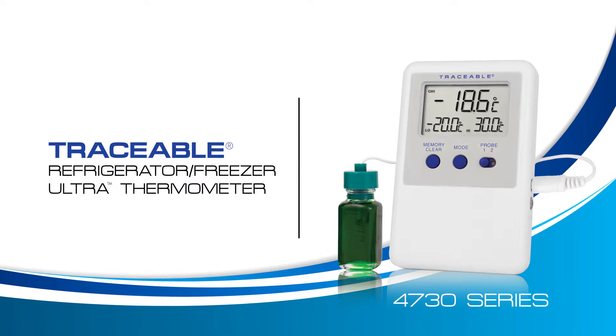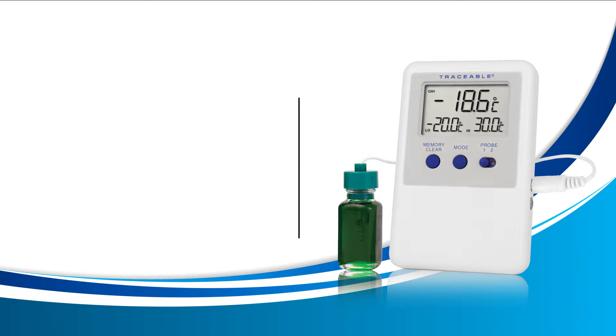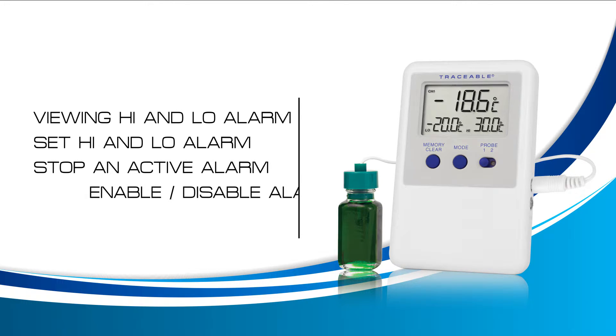Welcome to a Traceable Products instructional video for the Traceable Refrigerator Freezer Ultra Thermometer. In this video we will learn how to view your high and low alarm, how to set the high and low alarm, how to stop an active alarm, how to enable or disable your alarm, and the alarm properties.